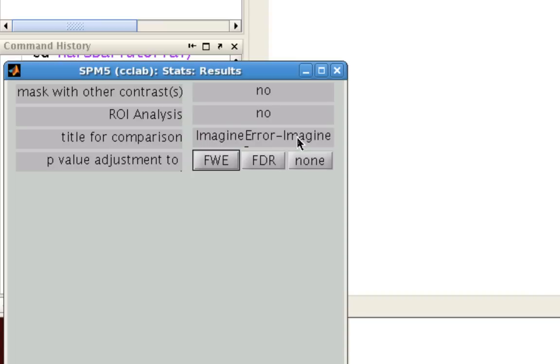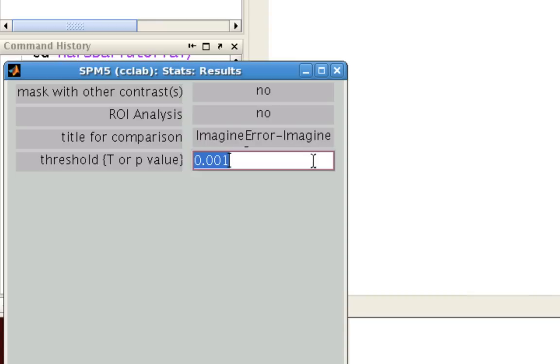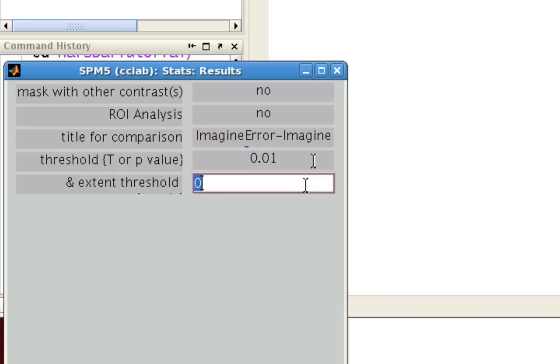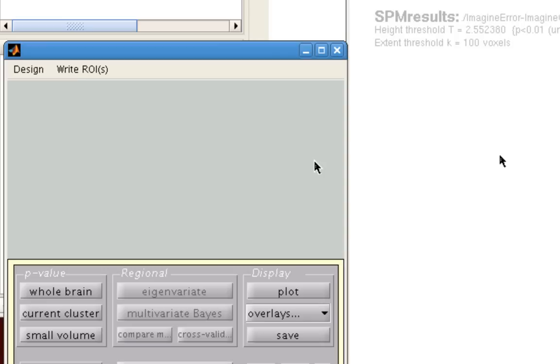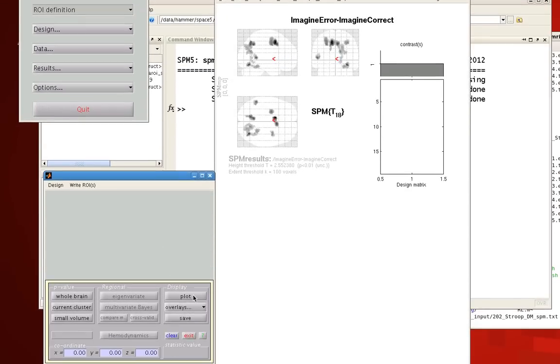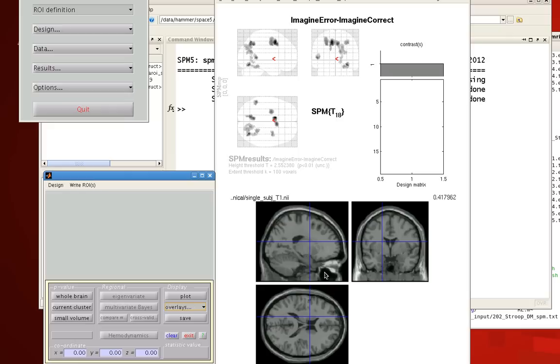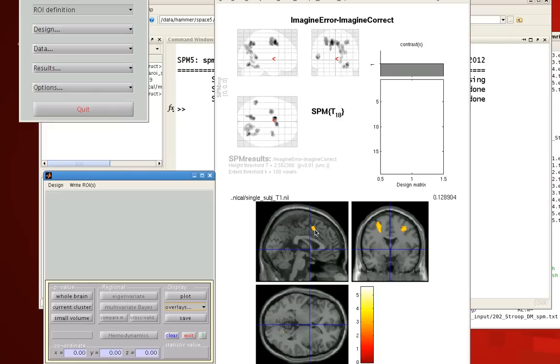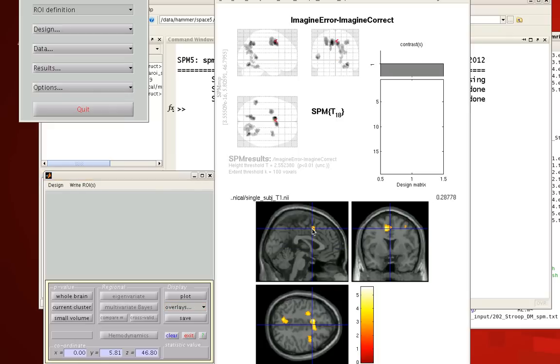Go through a few options here, and let's say I want to look at a contrast that's been corrected, or looked at a .01 uncorrected threshold, and let's say we've cluster corrected it at some threshold. So first of all, what we do is we find this cluster.